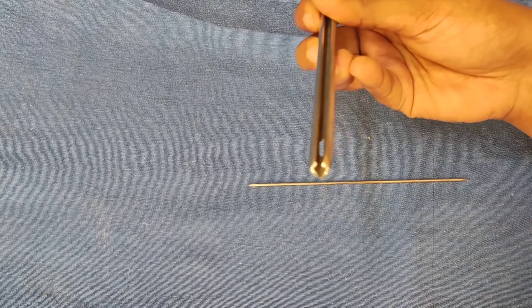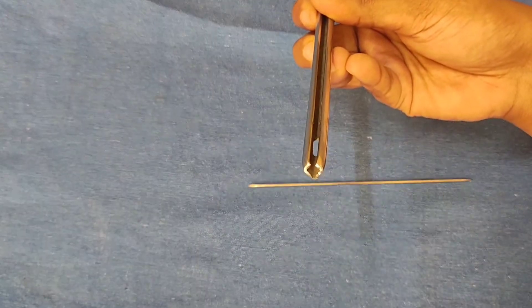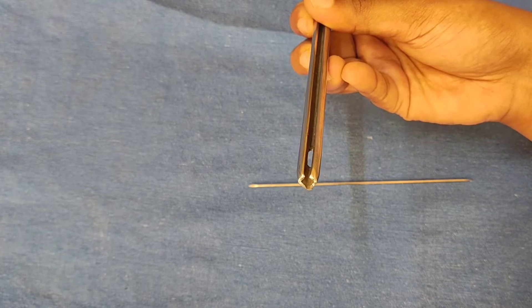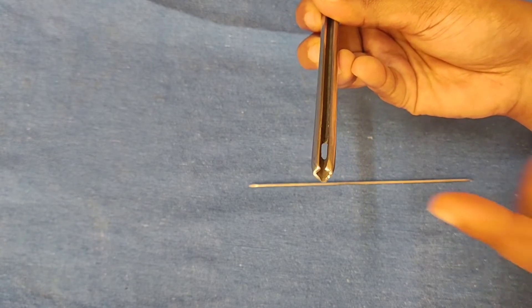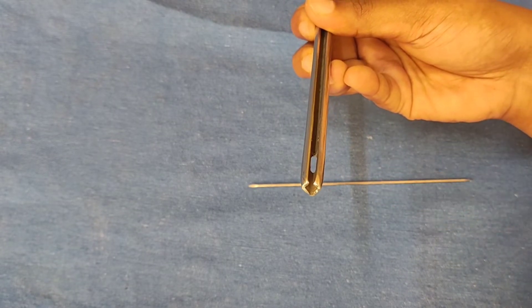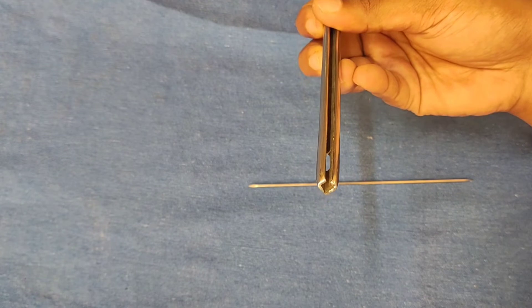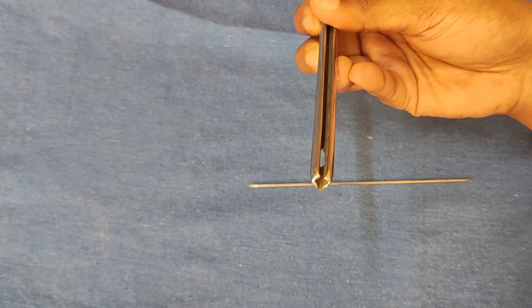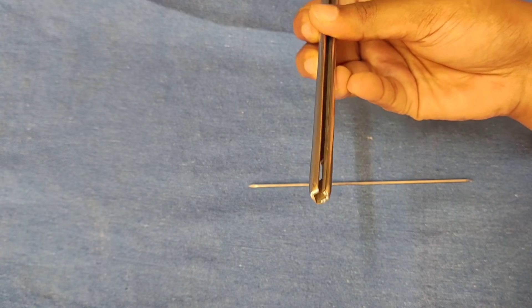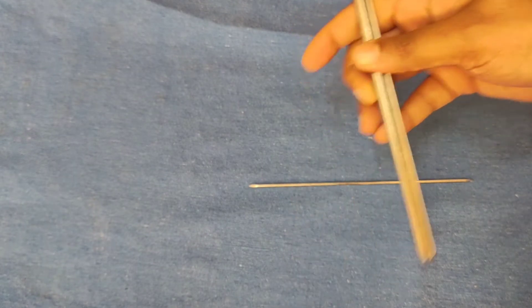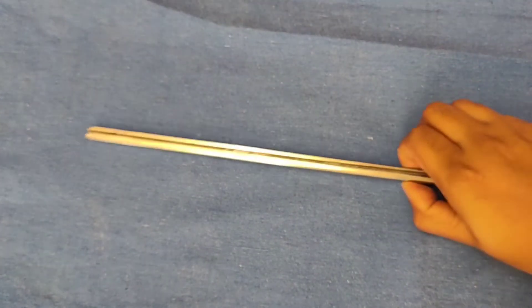Complications of K-nail: splintering of cortex, proximal or distal migration of nail, stucking of nail, nail bending and breakage, knee stiffness. Commonly available sizes are 6 to 15 mm diameter in variation of 1 mm when various lengths are available.